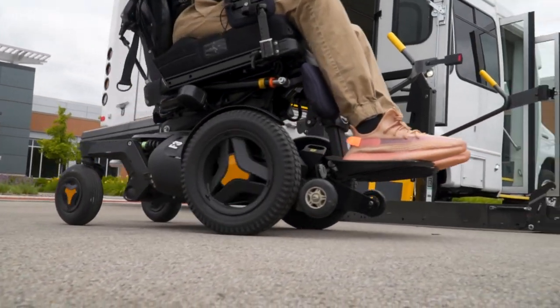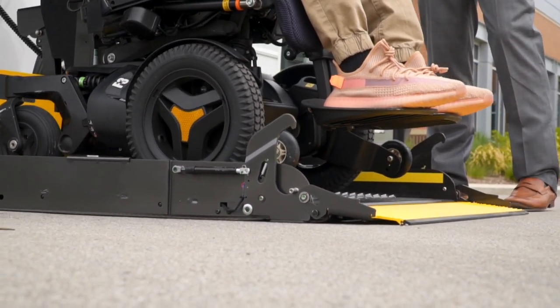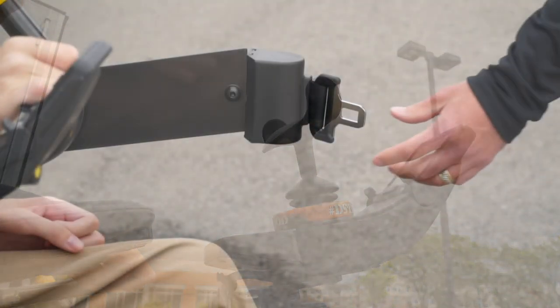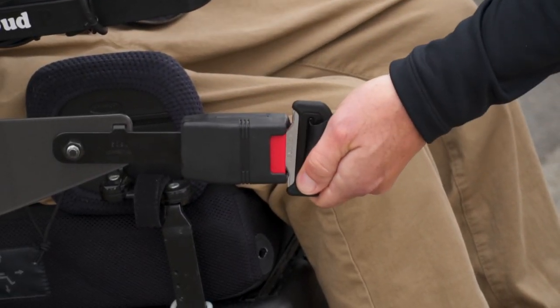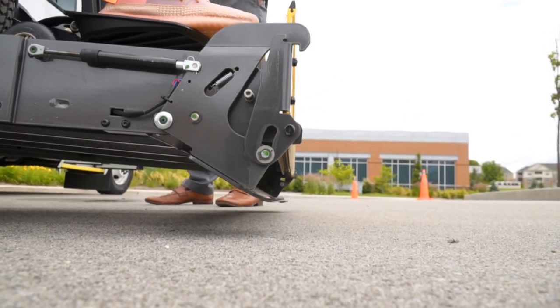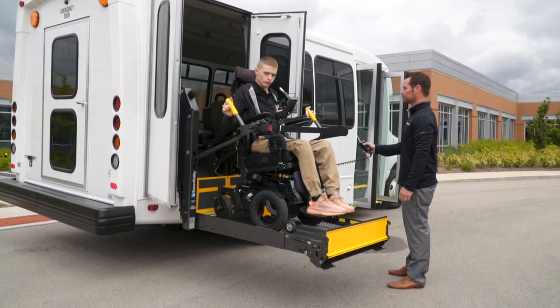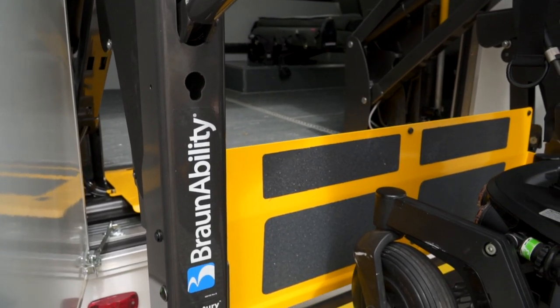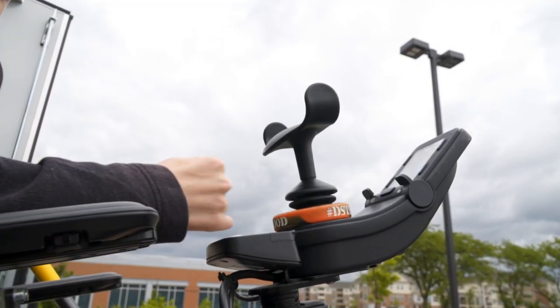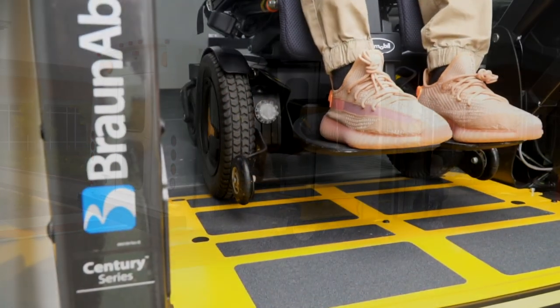To load a passenger, start with the platform at ground level and the outer barrier fully extended. Move the passenger onto the platform into position within the yellow boundaries. Lock the wheelchair brakes or turn off wheelchair power on powered chairs, buckle the handrail belt if equipped, and have the passenger hold the lift's handrails if possible for additional support. While being sure to stand clear of the lift, press and hold the up switch on the pendant control. This will allow the outer barrier to rotate to the upright and locked position and the platform to rise to vehicle floor level. The lift will stop at vehicle floor level automatically and the inner barrier will rotate to the horizontal or bridging position. Once the lift has stopped completely, re-engage power to power chairs or disengage wheelchair brakes and move the passenger into the vehicle compartment.